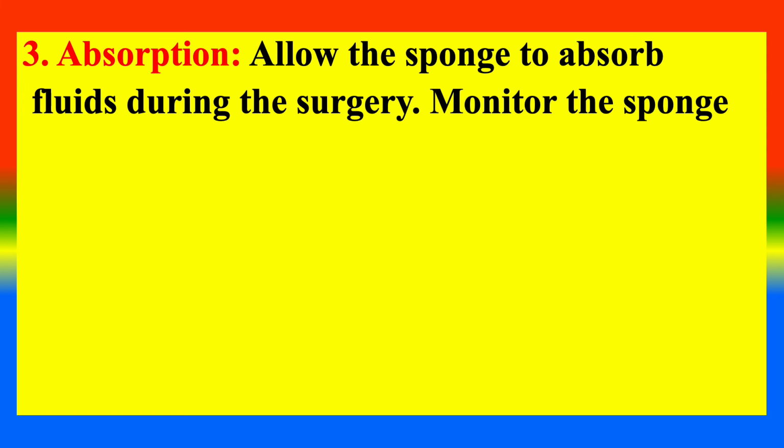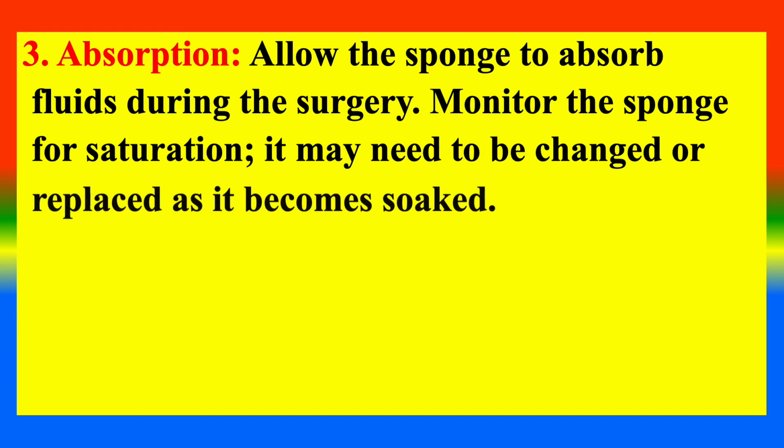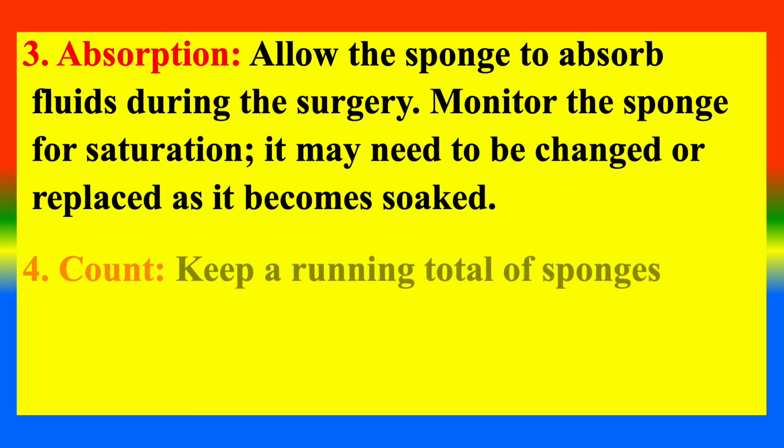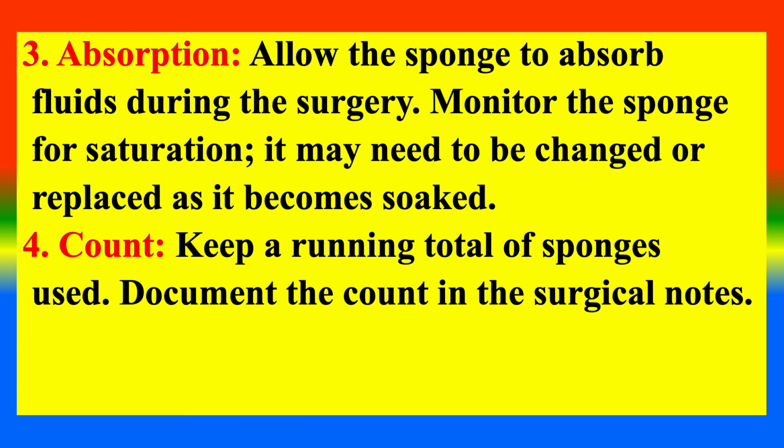3. Absorption. Allow the sponge to absorb fluid during the surgery. Monitor the sponge for saturation. It may need to be changed or replaced as it becomes soaked. 4. Count. Keep a running total of sponges used. Document the count in the surgical notes.